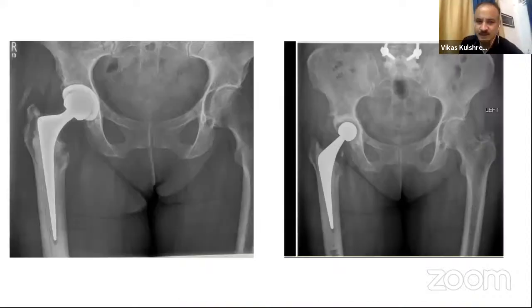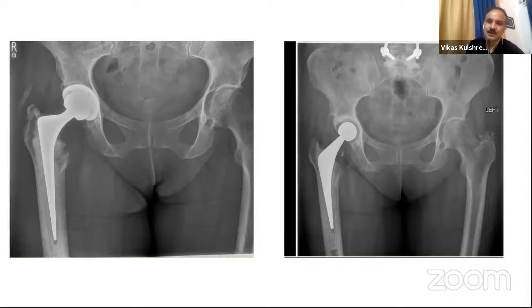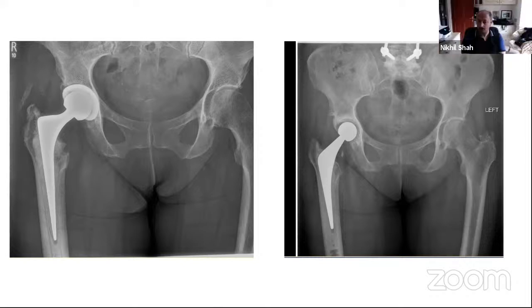Now, this is the primary and this is the revision. You are following what Endoclinic says. Actually, in Endoclinic, they say when you have an infection, you have to keep going shorter because infection takes years to cure, and the more you use up the distal canal, the worse the patient fares. But the philosophy at Wrightington is to make your revision look like a primary, not your primary look like a revision. Go short, restore the bone, give it back. The primary is on the left, the revision is on the right.